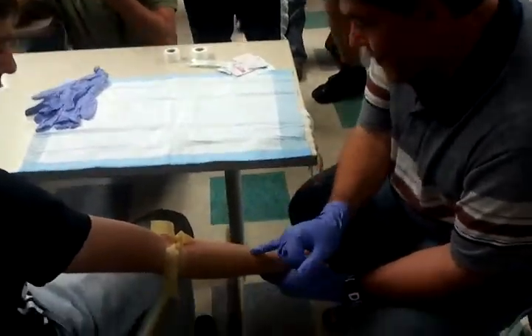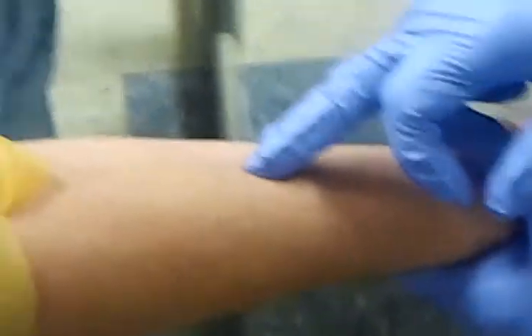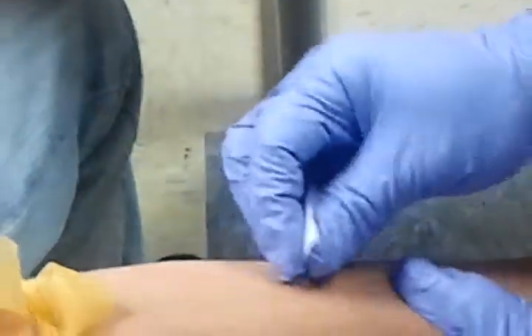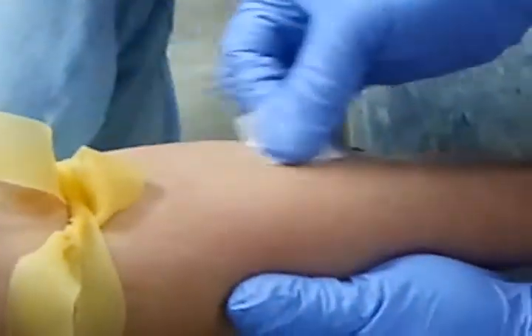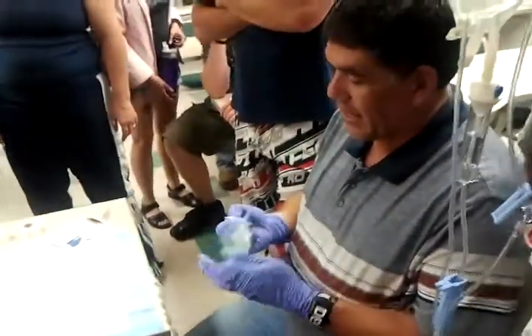I can see that vein all the way down — it's not poking out all over the place. I've got one here and one here; I'm going to go for this one right in the middle. It doesn't look like a really big vein and I'm trying an 18 gauge, but I think I can do it — this is going to be a challenge. For traction I could also do this; see how it's pulling? I can see that whole vein right there. Now I have to decide how deep it is and go from there. My goal is to get into the skin and into the vein at the same time.